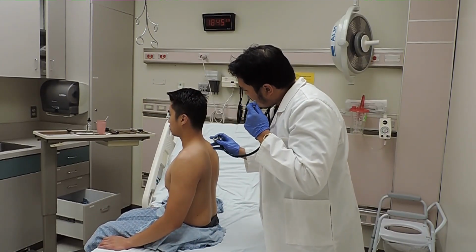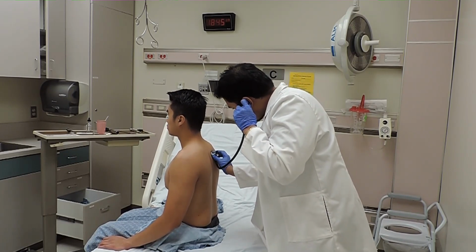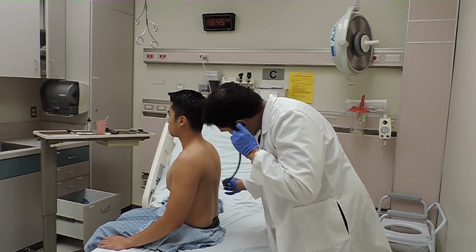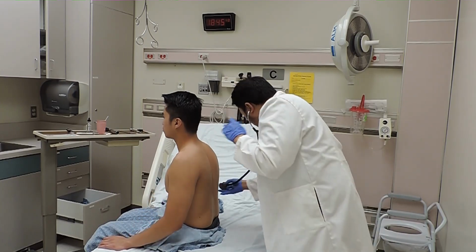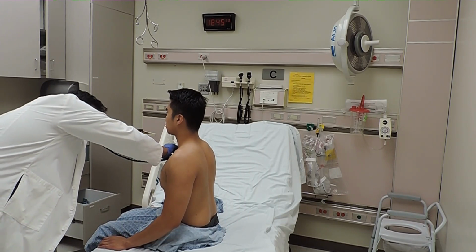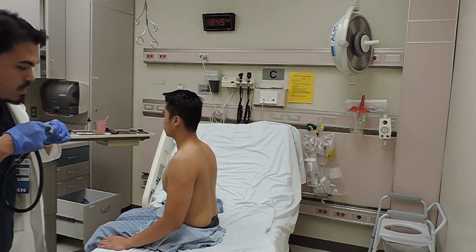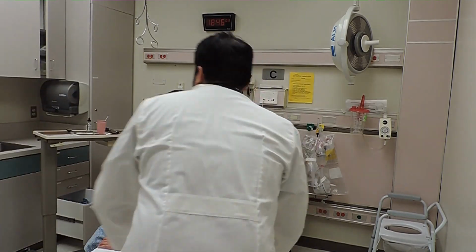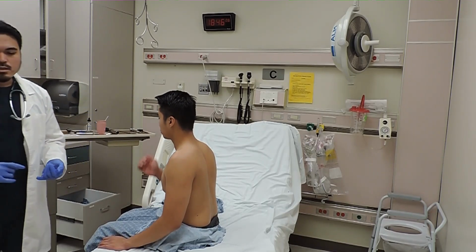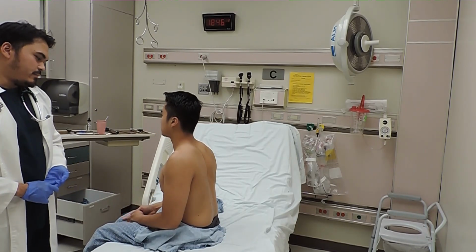If you feel the stethoscope, just take a deep breath and exhale, okay? Okay, good. Deep breath. All right. Lung sounds are clear on all lobes, on both posterior and anterior aspect of the lungs. There's no adventitious sounds such as crackles, wheezes, or rhonchi, or pleural friction rub.